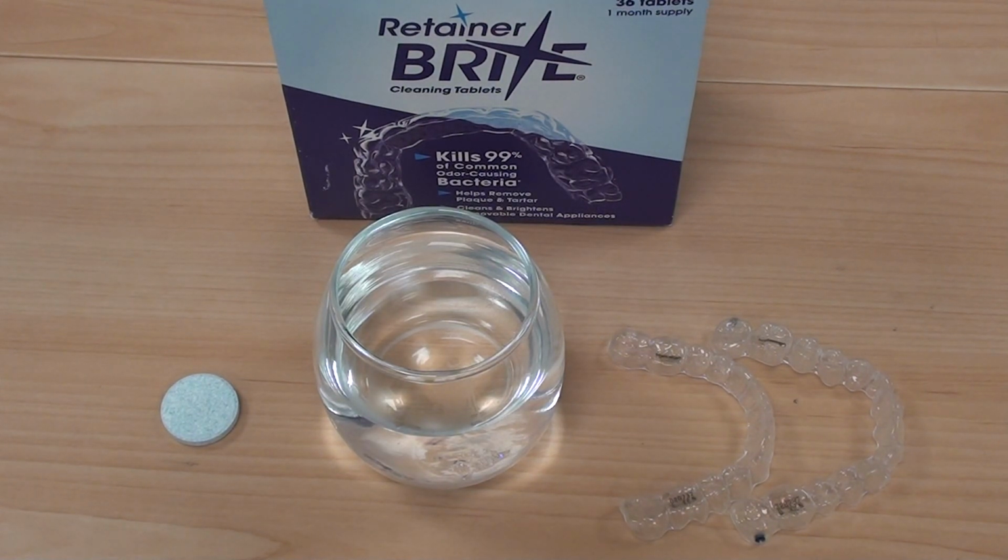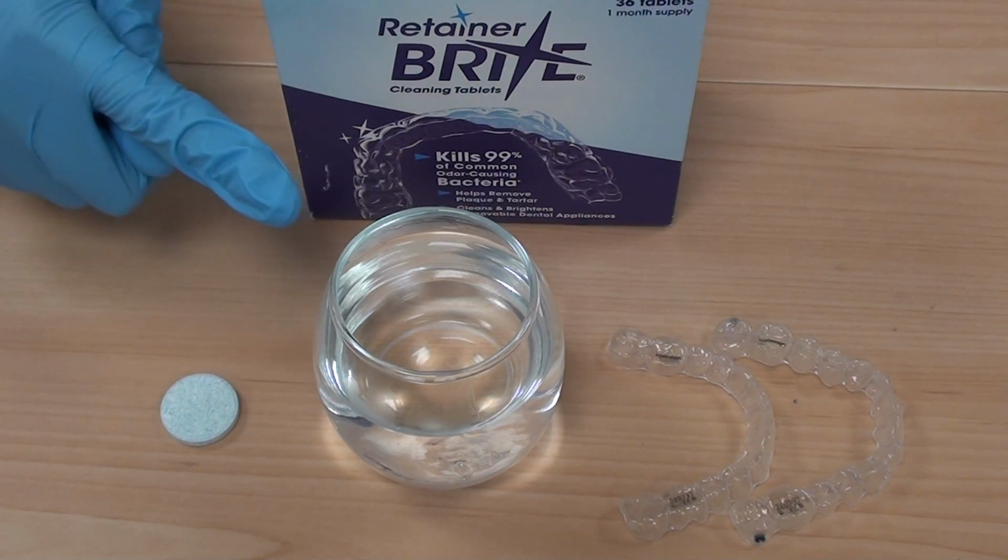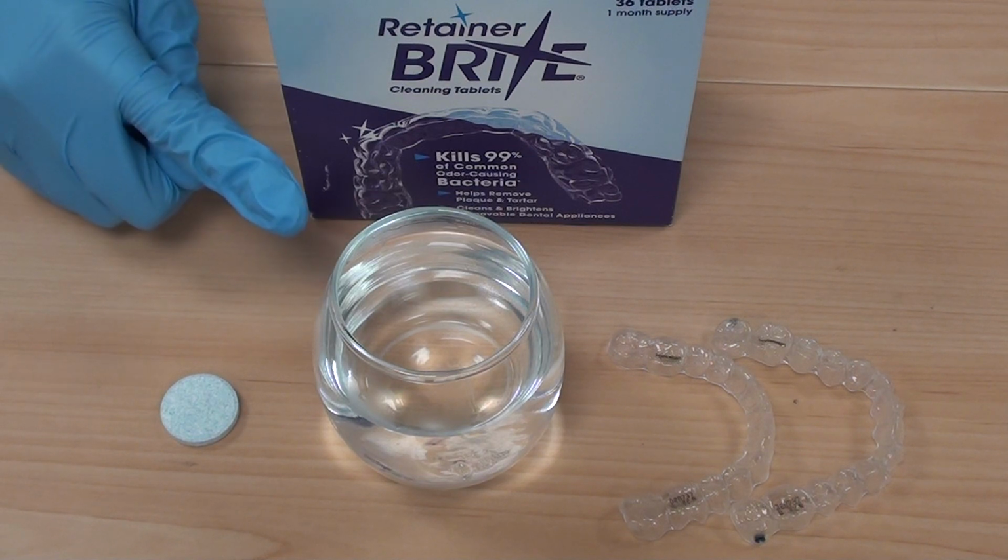In this video, we are going to show you how to clean your aligners using a product called Retainer Brite. For best results, this should be done daily, but you should at least use this once a week to clean your aligners. Get yourself a cup and place enough warm water.